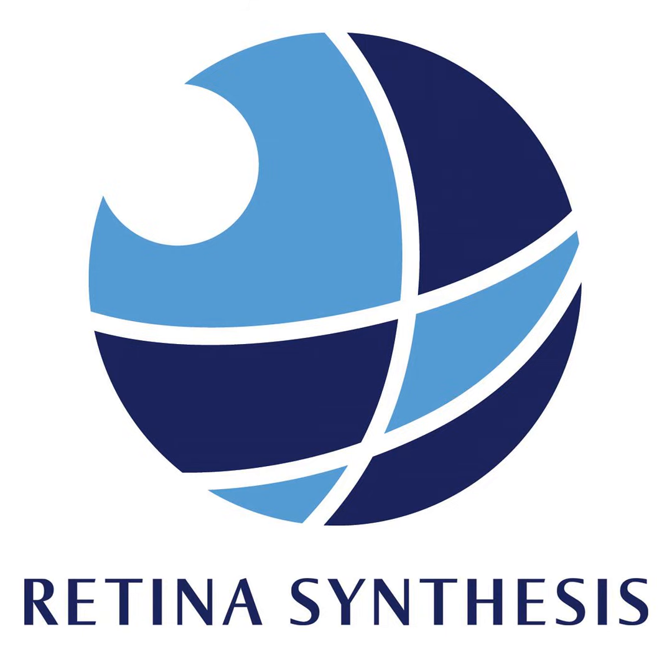If you repeat that OCT scan multiple times in the same section, the backscatter varies if it hits a moving particle versus a non-moving particle, so that you can see red blood cells moving. By doing that, people have been able to generate very nice maps of the capillaries and the larger vessels in the retina. And just like regular OCT, it's depth resolved.